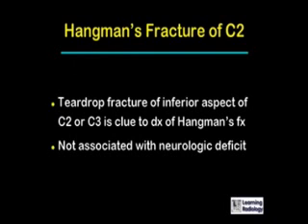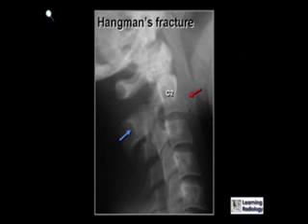Hangman's fractures may manifest as a teardrop-shaped fracture on the inferior aspect of the body of C2 or C3, so that's an important clue to look for on the lateral radiograph. Hangman's fractures that occur as a result of motor vehicle collisions are not associated with neurologic deficits.